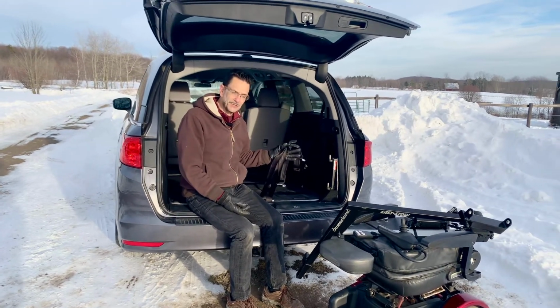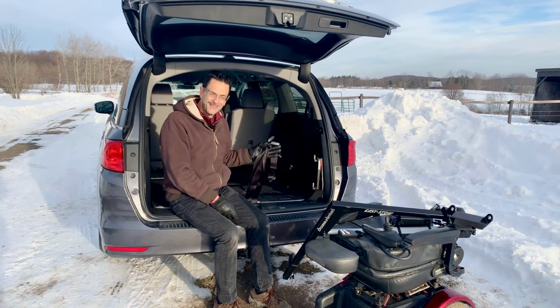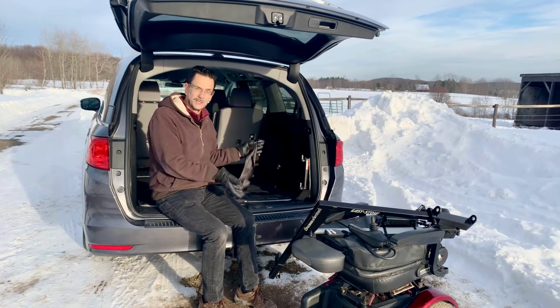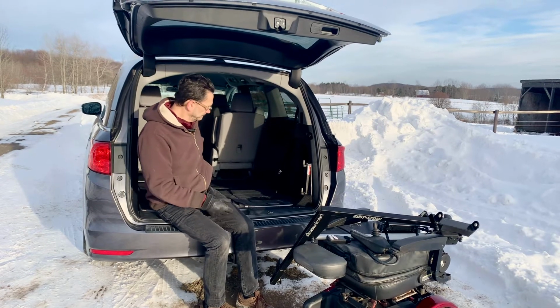These belts are meant to keep the wheelchair from rolling around and also to stabilize the lift. They are not meant as a wheelchair tie down. They're only to keep the wheelchair from rolling around. Do not use it as a wheelchair tie down, or put a person in it. That's not what it's meant for.